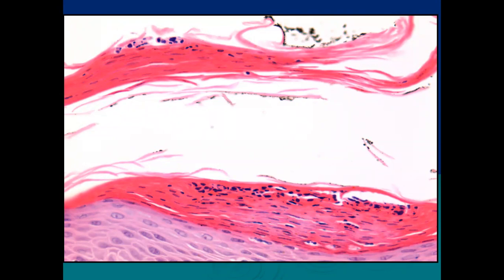And if neutrophilic abscesses are seen in hyperkeratosis without any parakeratotic columns, then the diagnosis is likely to be a fungal infection. You should differentiate these neutrophils from the nuclei of the parakeratotic cells, because in parakeratosis the nuclei are elliptical or longitudinal, present along the long axis of the stratum corneum, while the nuclei of neutrophils in Munro abscesses are small and round.